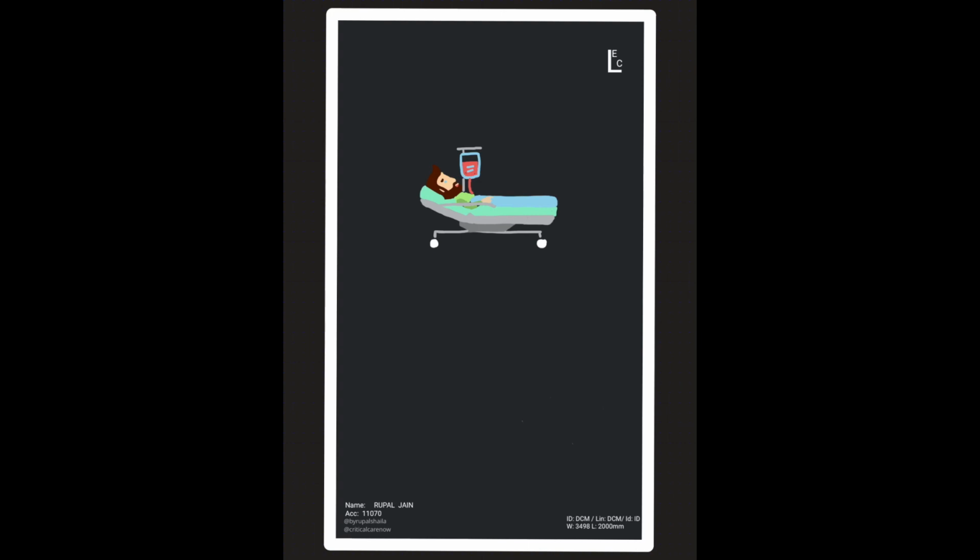Okay, so we have our patient who has arrived to the triage door with ischemic stroke symptoms, a high NIH stroke scale, and he's outside of the window for thrombolytics. I want to go through what his initial evaluation looks like and how exactly a CT perfusion is performed in combination with CT and CTA.